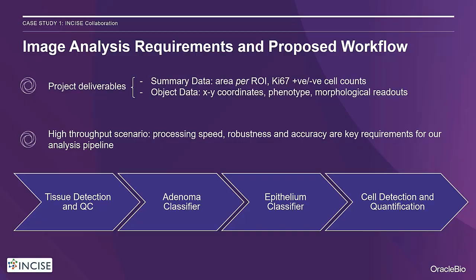So on the next slides, I'm going to walk you through each step of the workflow, showing you some examples of the output generated and also the pathologist validation processes used throughout.